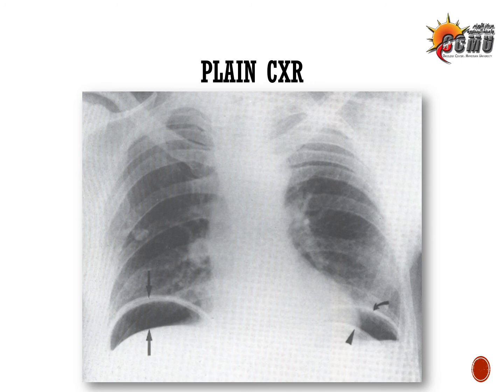So the next question is going to be, what's your differential diagnosis? So you should know the causes of air under diaphragm, or in other words, causes of pneumoperitoneum, the ones that we've mentioned before, most importantly perforated viscus, perforated inflammatory or malignant bowel, after laparoscopy or laparotomy, and so on.